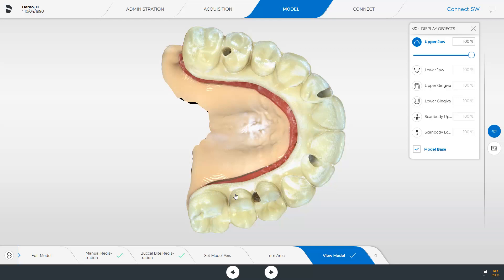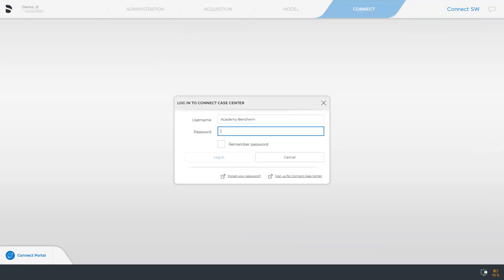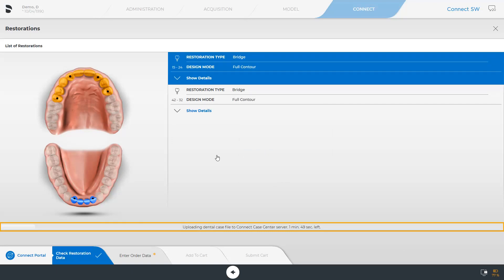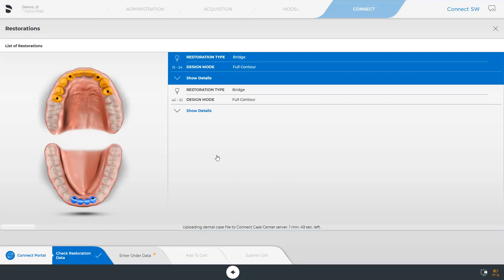Back in the model phase, we skip checking the virtual models and switch directly to the last phase, the Connect phase. At this point, please make sure that a secure internet connection has been established, since now you will automatically be connected with your Connect Case Center. In case you have not yet created a customer account in the Connect Case Center, select Sign up for Connect Case Center. Since we have already registered, we simply enter our password and log in. At the bottom of the screen, the upload status is displayed. In this step, the restoration data can be reviewed once again, and we proceed with the Enter Order Data step.